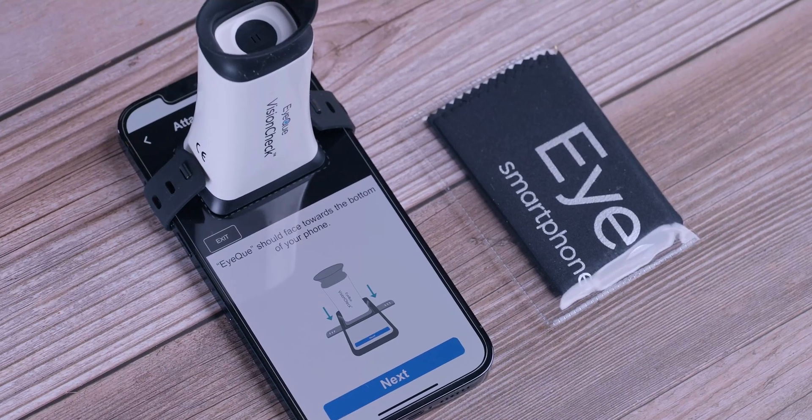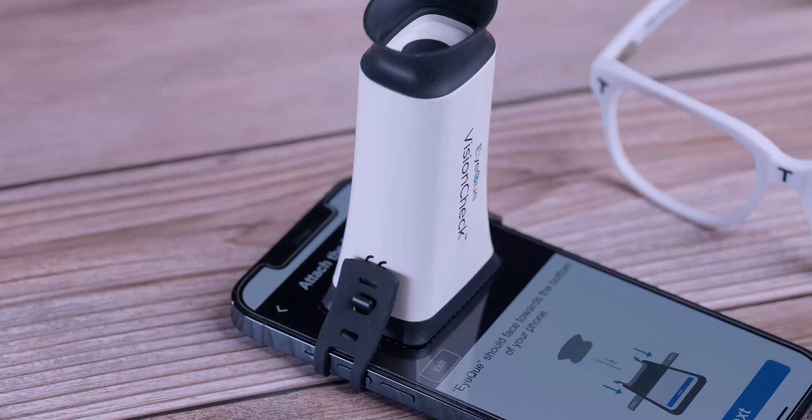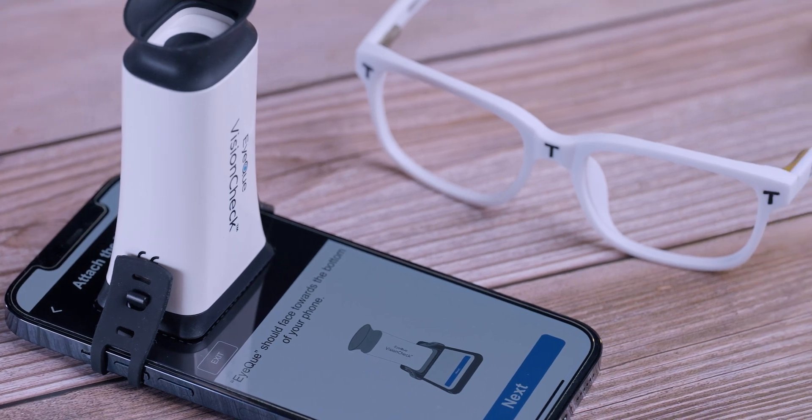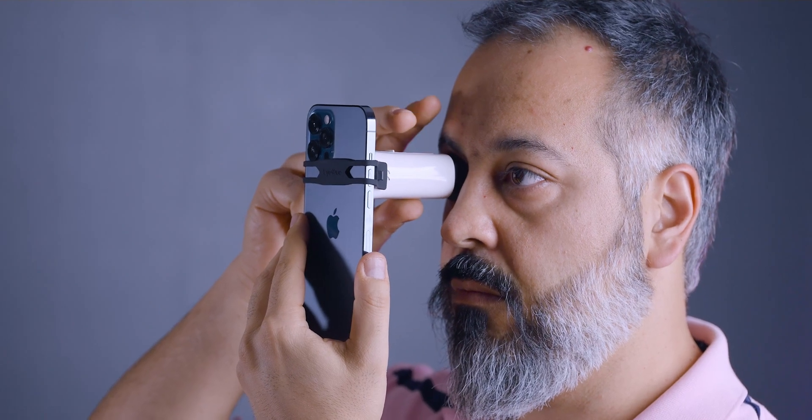So how do you actually use this? This is not an instruction video — I'm not going to duplicate the videos on their own site. It works with iPhone and Android. You download the app, register the device using the serial number, pair the device, and start the test. The app walks you through aligning the device on your phone, and you test one eye at a time. The very first time, it walks you through a practice run, and then you do three full tests — nine alignments for each eye per cycle.